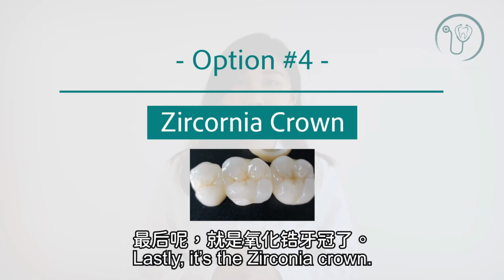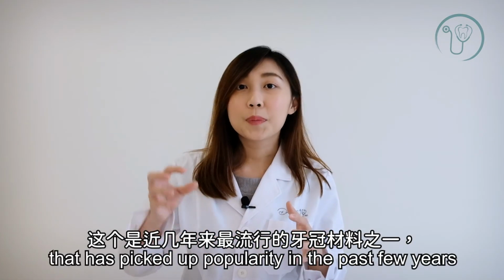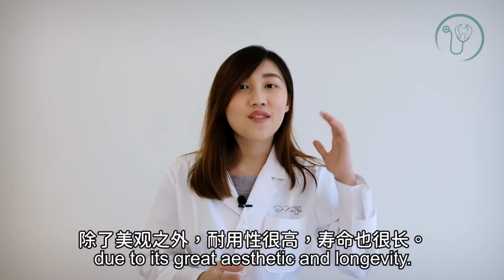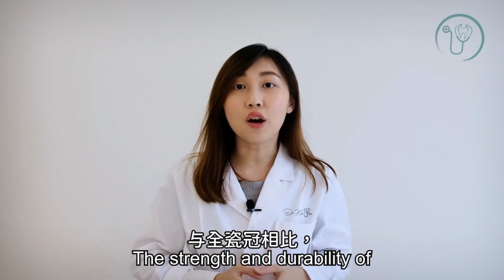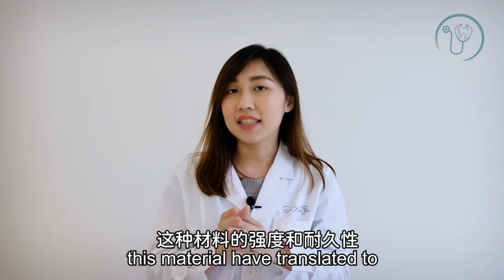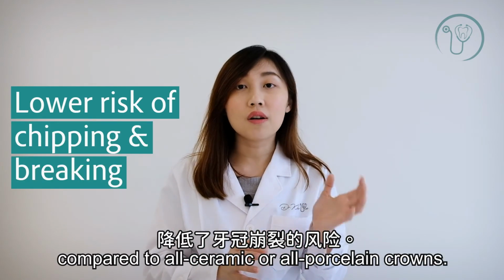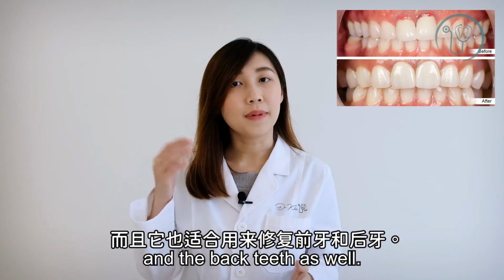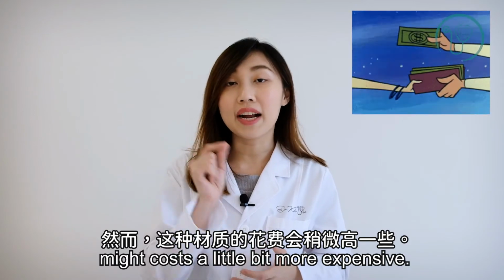Lastly is the Zirconia crown. Zirconia is a relatively new type of crown that has picked up popularity in the past few years due to its great aesthetics and longevity. The strength and durability of this material has translated to a lower risk of chipping and breaking compared to the all ceramic and all porcelain crown. It can be used to restore the front and the back teeth as well. However, this type of material might cost a little bit more.